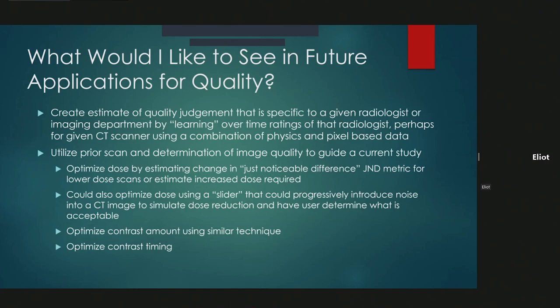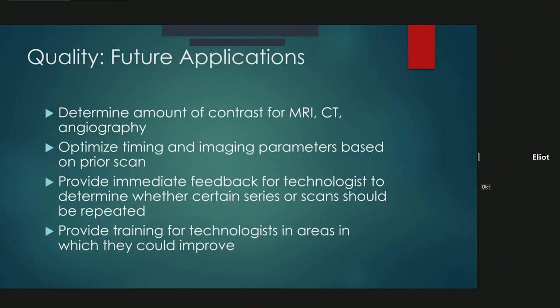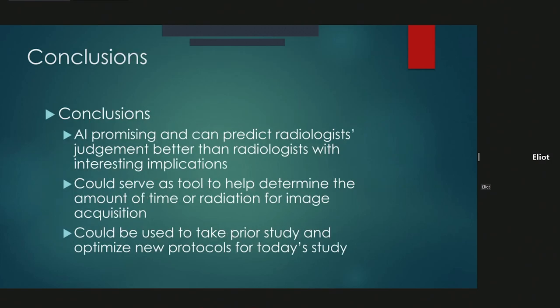And I think being able to have AI-related mechanisms that are analogous to what's used for reconstruction could really play a major positive role in allowing us overall to reduce doses for patients. And so in conclusion, I think AI is promising and can predict radiologists' judgments overall better than individual radiologists, based on the study that Dr.